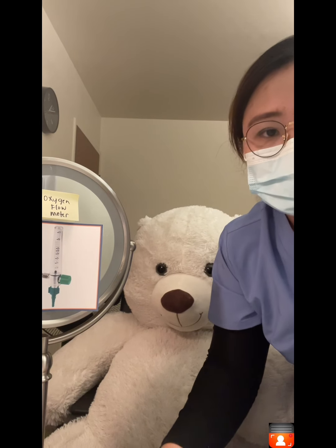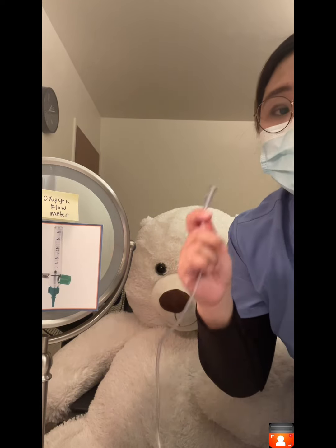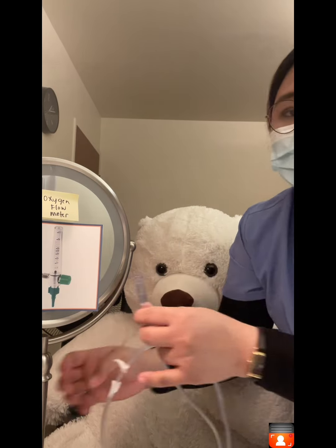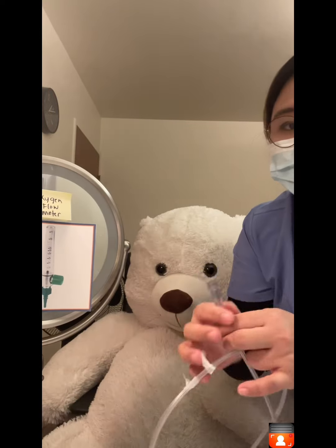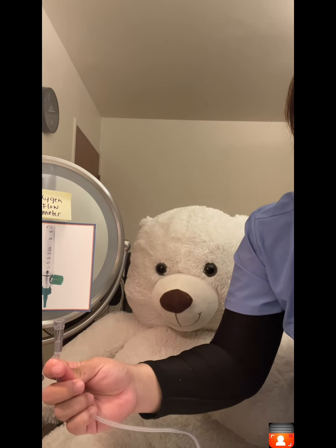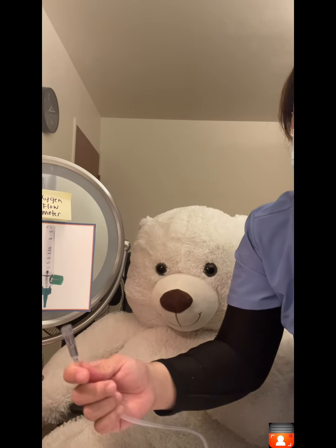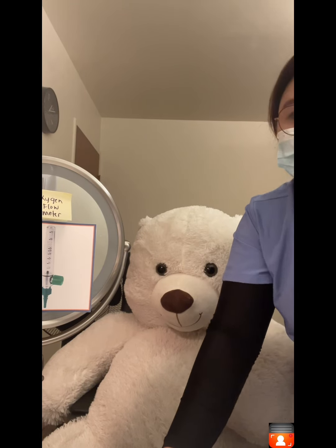So now, to set up the oxygen and humidifier, we have to look for the end connector and connect it to the oxygen source. So let's assume that I have an oxygen tank here. Turn on the oxygen at the prescribed rate, ensuring proper functioning, and then adjust the flow rate as ordered and check if it is flowing out of the prongs.